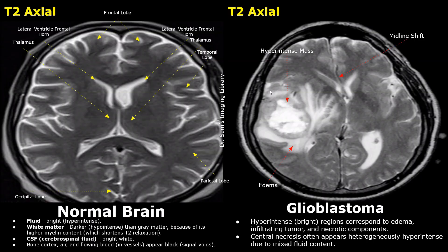The central necrosis often appears heterogeneously hyper-intense due to mixed fluid content. This is the mass and it is surrounded by vasogenic edema. This is the edema.